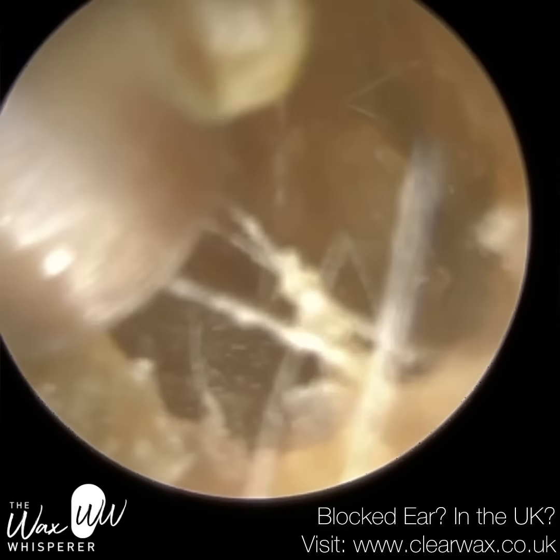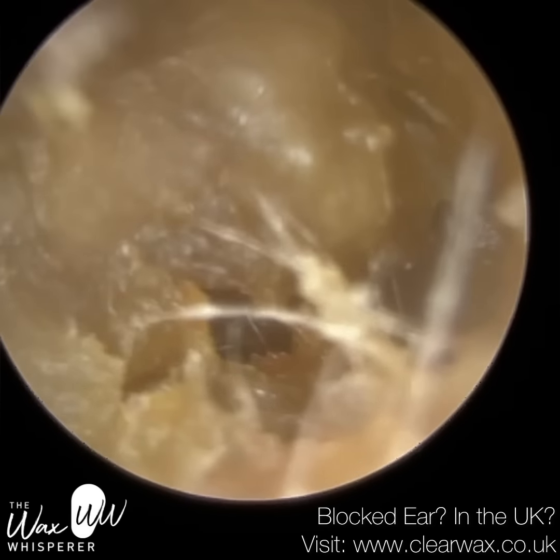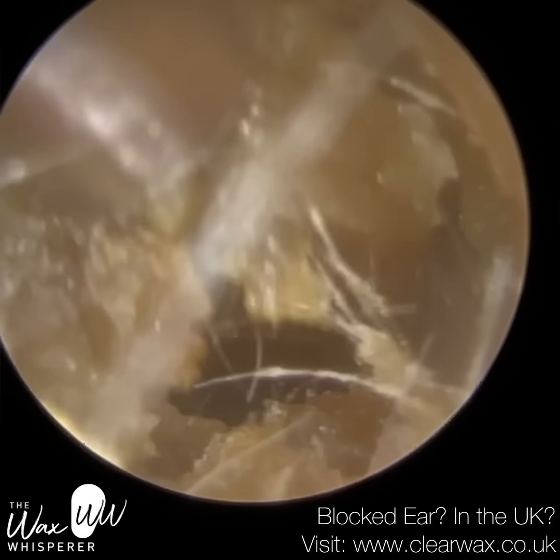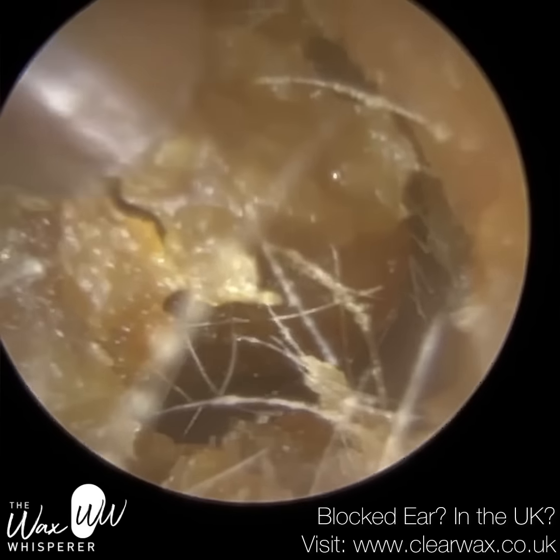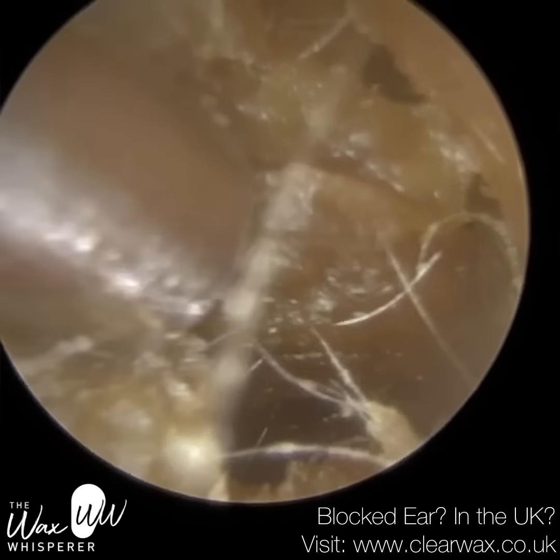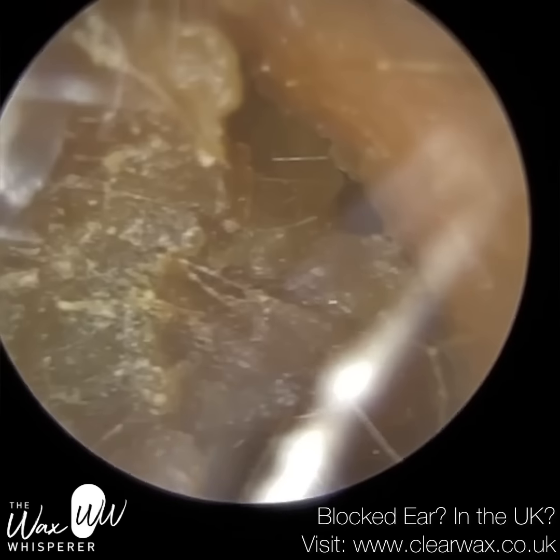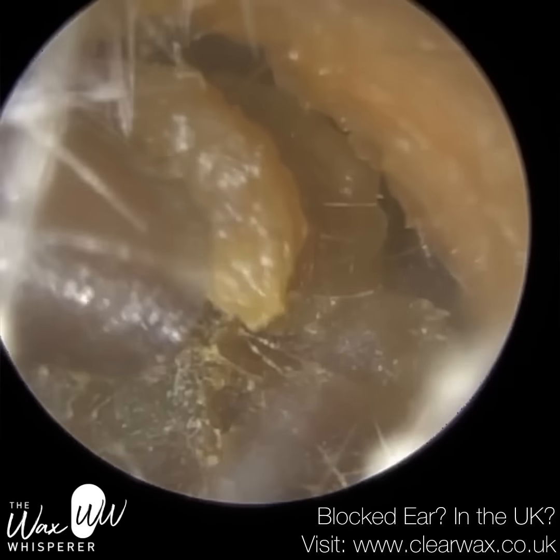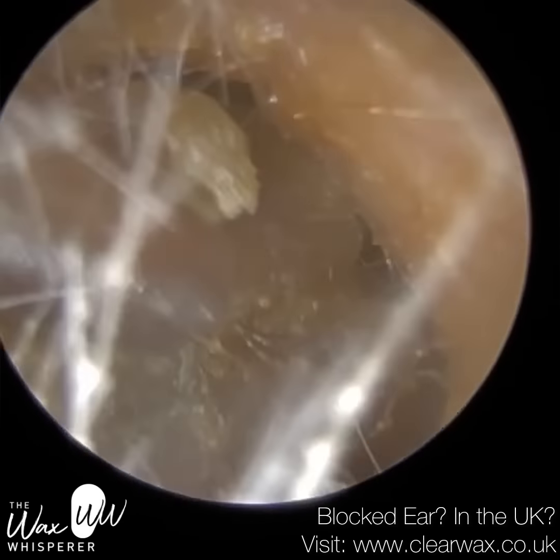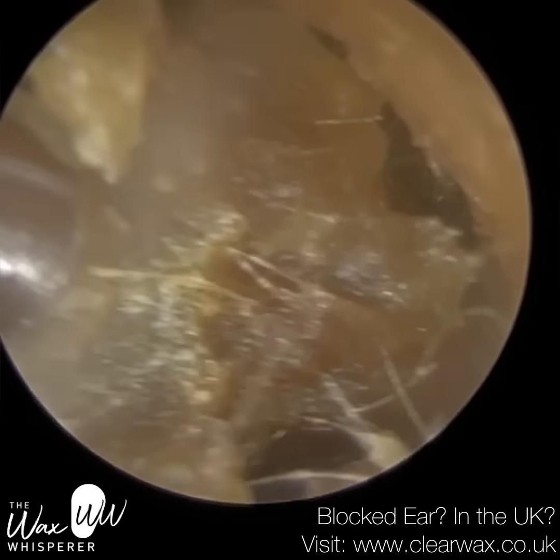So this is patient one — they attended with a blocked right ear, and we're just at the entrance here. You can actually subdivide the ear canal into three separate sections. The outer third is the cartilaginous portion — I typically call that the lateral portion, but you can actually call that the pars externa. Then the middle section is the pars media, and the latter third of the ear canal is the pars interna.